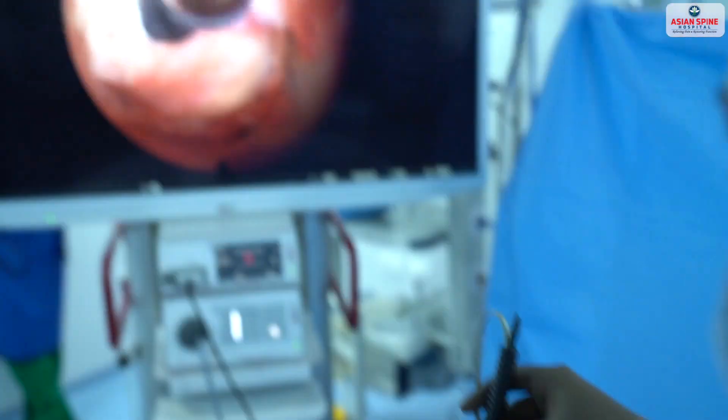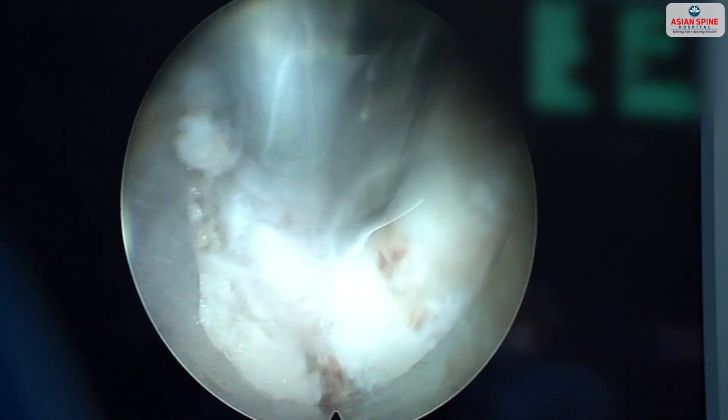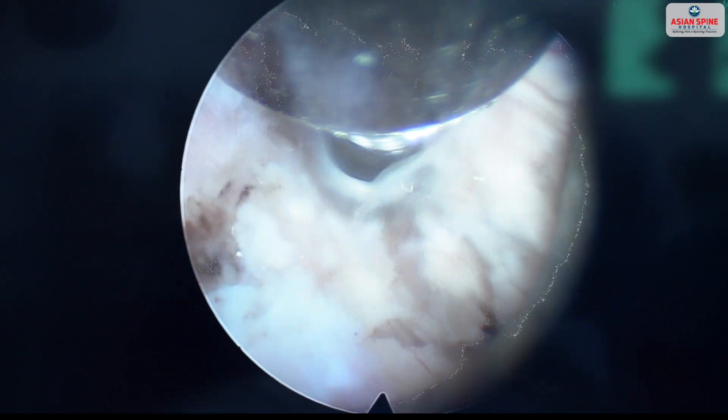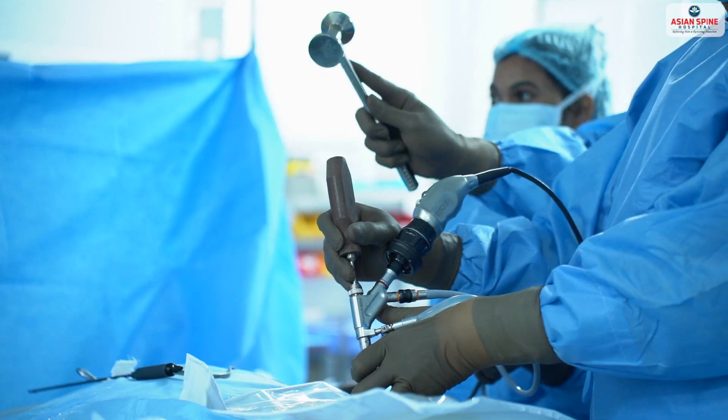Now you can see on the monitor a clear picture as we remove the soft tissue from the bone. Once we delineate the lamina, the pars, and the facet, we use a chisel to break the pars.